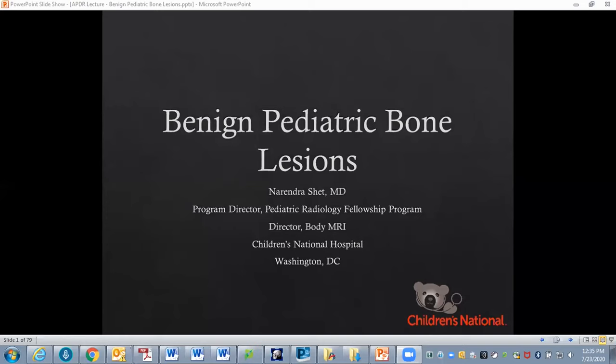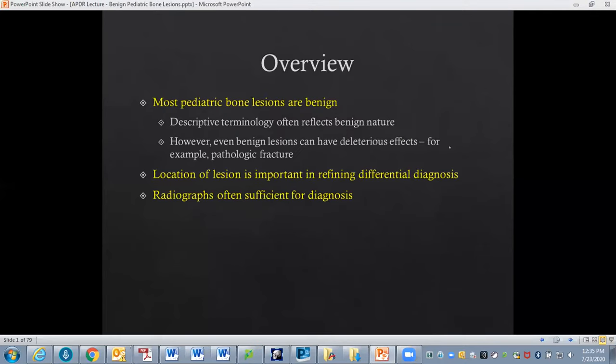We're going to do a whirlwind tour of benign pediatric bone lesions. I'll try to give you some pearls and things to remember, particularly for those of you who will be taking boards shortly. The important thing to remember is that most pediatric bone lesions are benign. The location of the lesion is particularly important in refining your differential, and radiographs are often sufficient for diagnosis. The big things to remember are: transition zones, location of lesion, lesion matrix, and presence or absence of periosteal reaction.